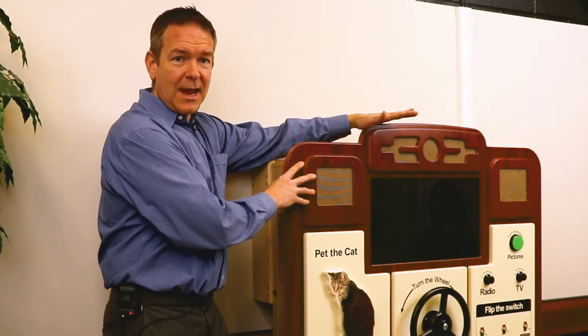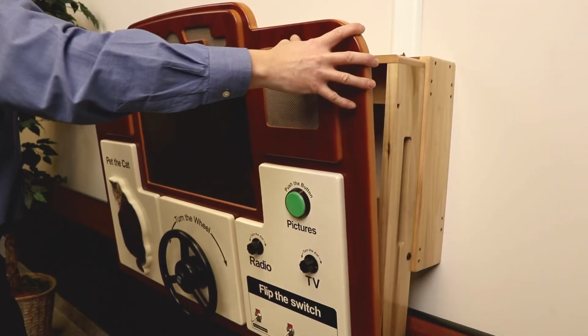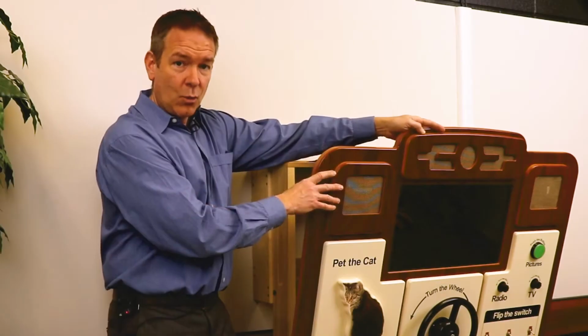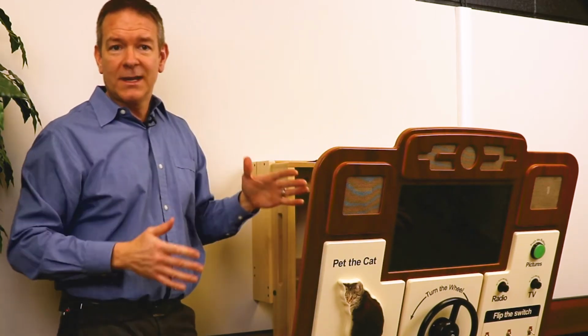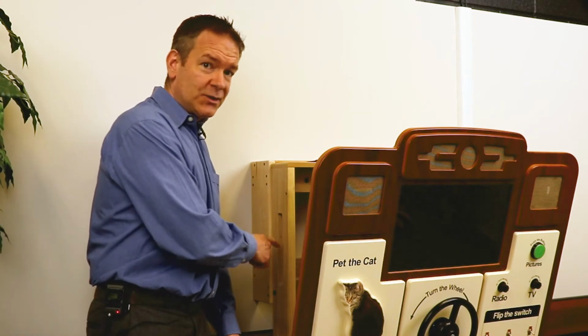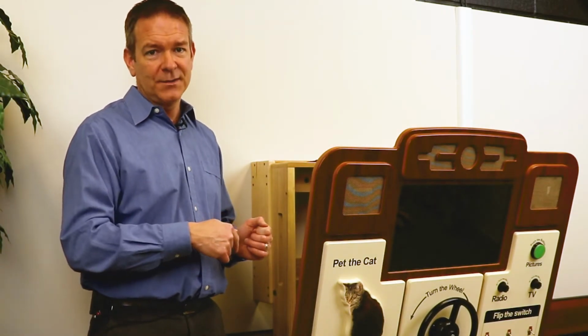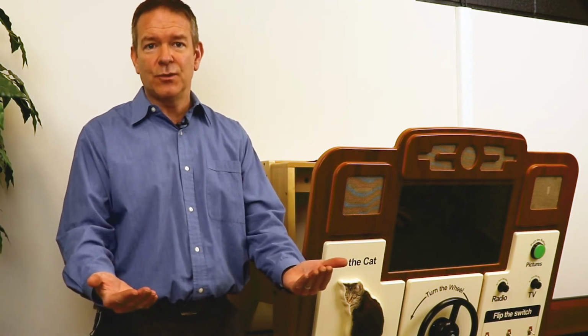Carefully open the Abbey, holding the top of the panel and slowly tilting it from the top towards you. Don't worry, there are a few support cables to stop it from falling all the way down. Notice the screw buttons holding the support cables as an added safety measure. In the next step, we'll be detaching the support cables from the screw buttons so we can open Abbey all the way down and access the computer.